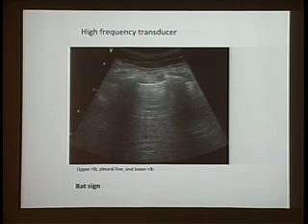And also, when you're looking at here, you can modify some of your views. This is more into the lung ultrasound that is not necessarily part of the FATE exam, but I think it's so powerful that we're using it more and more. And it's to put your probe between the ribs. So you get your linear probe, the same one you use for your regional procedures, and just put it between the ribs. So you're going to get this image.